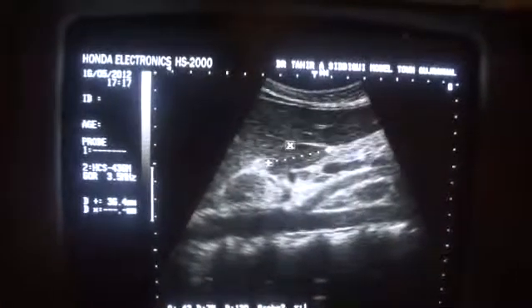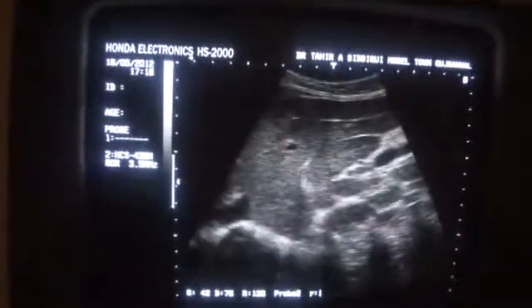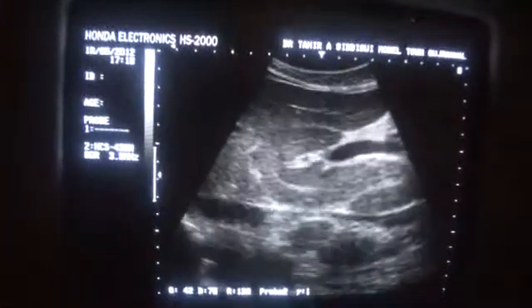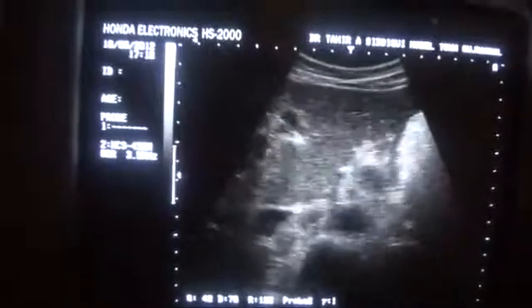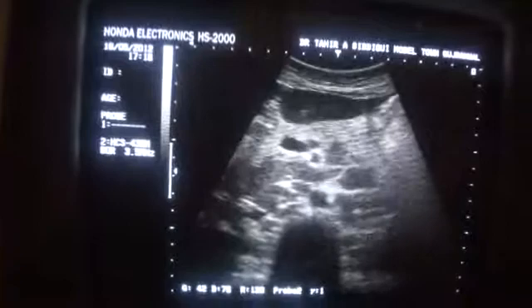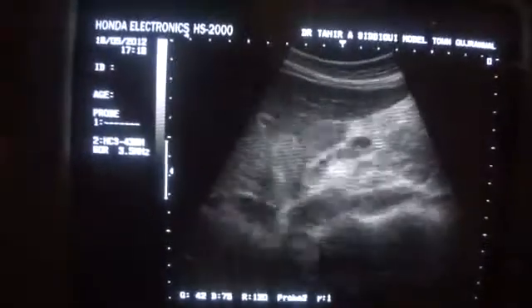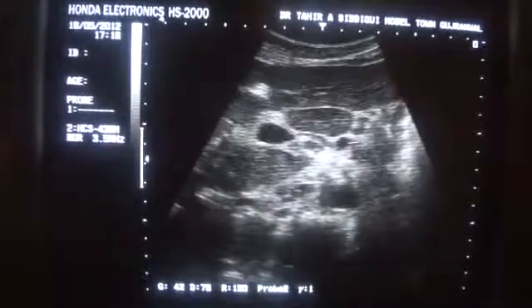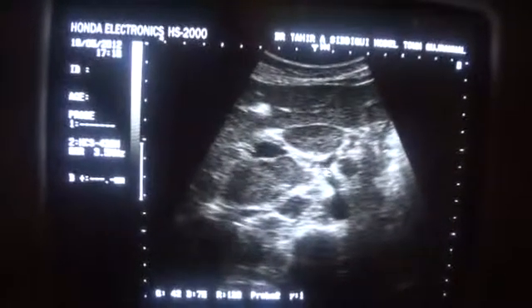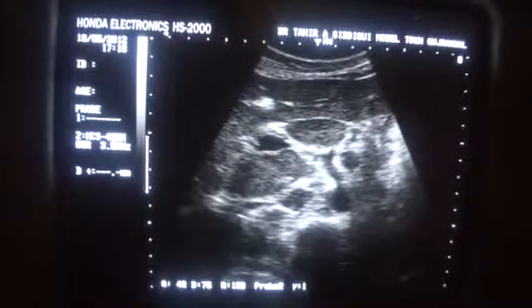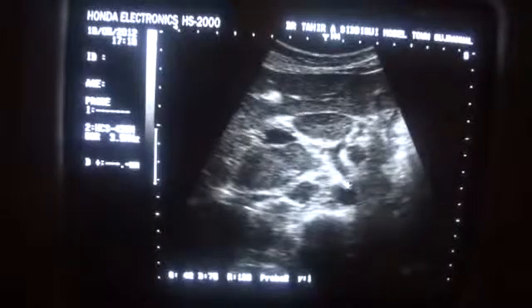This one measures 36 x 13 mm. There are para-aortic lymph nodes in the para-aortic region of significant sizes. You see this lymph node is sitting over the area of the origin of the celiac artery, and the left gastric artery. So this is the lymph node, and this is the aorta in transverse section.